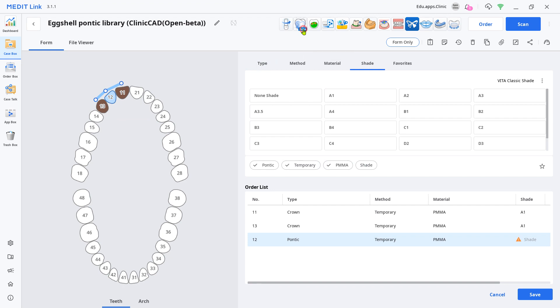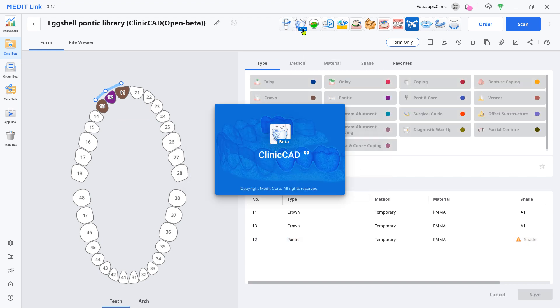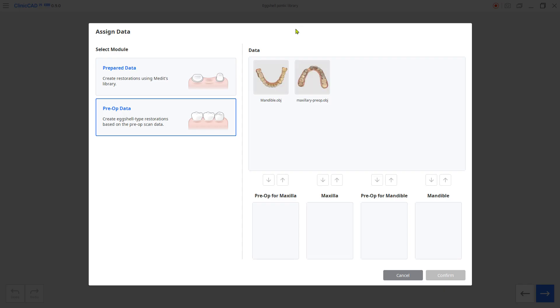Load your files into the Clinicad app, choose the pre-op data mode, and assign your pre-op data to the pre-op slot.